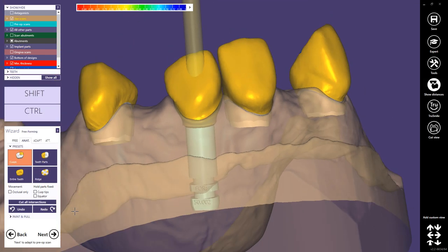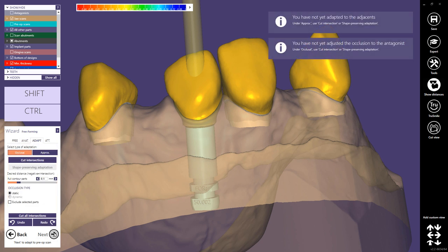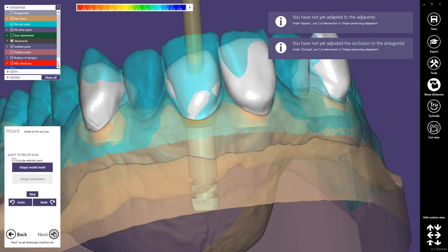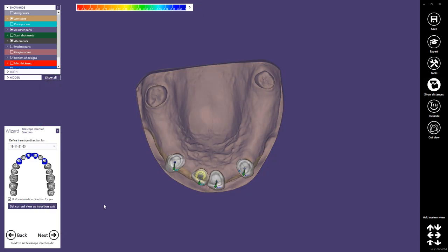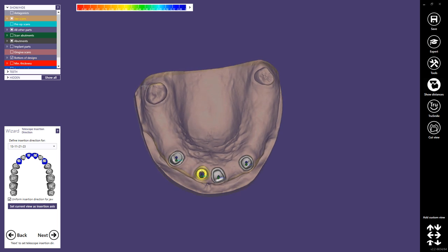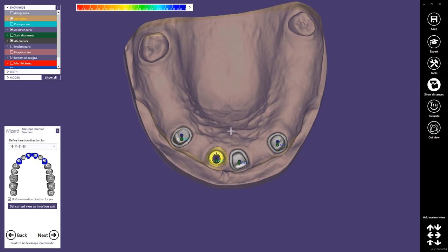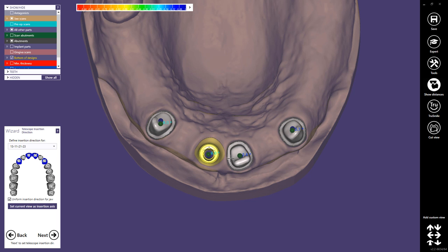We can skip the freeform step, as we don't need any anatomical information to design our telescopes, and the step to adapt to the pre-op scan can also be skipped. This next step is very important: the telescope insertion direction. Here we have to define not only the insertion direction for the secondary crowns on the telescopes, but we also have to define the insertion of our removable later. We need to find a compromise so that the milled parallel parts of the telescopes are as thin as possible.